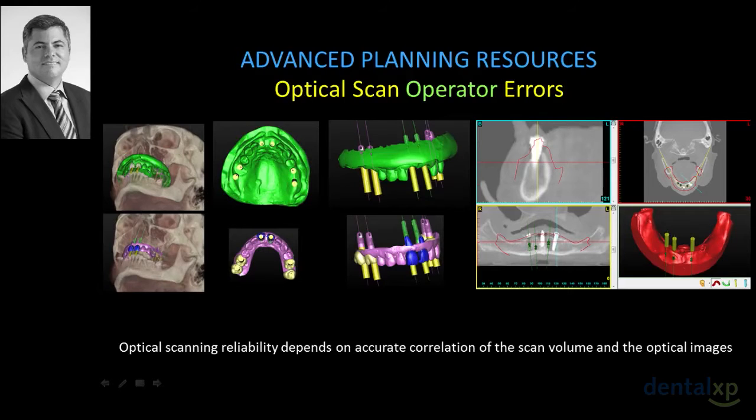So another situation that you have is that when you are performing this type of models, if you are using a countertop, you need to trim all these edges, because otherwise the appearance is not going to be the best, and it's going to block some of the other structure that you might need. So remove any stone that you need, trim it before you even scan that model. Clean anything that you need to clean in the stone, and then do the scanning. Today most dentists are implementing intraoral scanners, and it's facilitating this type of work.